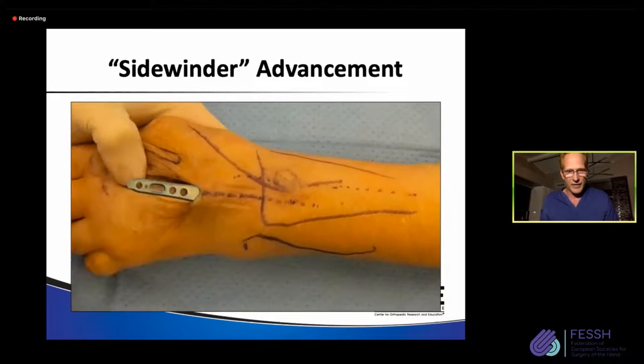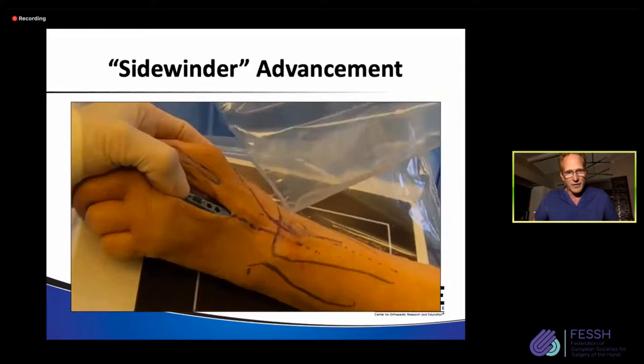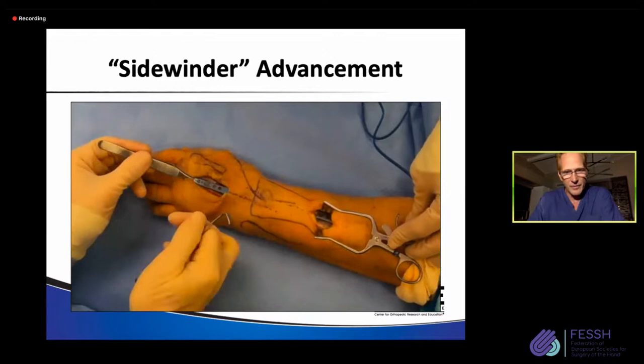Now, I overshot this a little bit because the proximal portion of the plate is a little bit more radial. That just needs a minor adjustment in and out. And then you're going to see it lies perfectly right where it should be. I think that's the end of the video really. So now we've made two small incisions to fix the plate to the metacarpal, fix it to the radius.